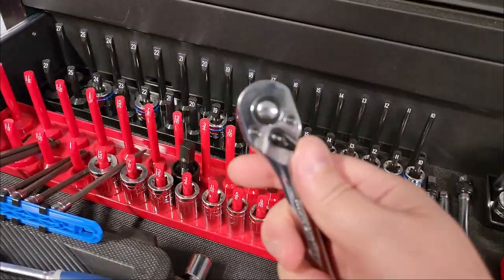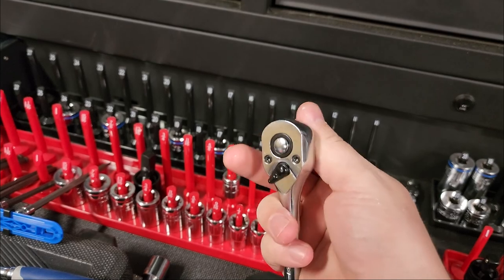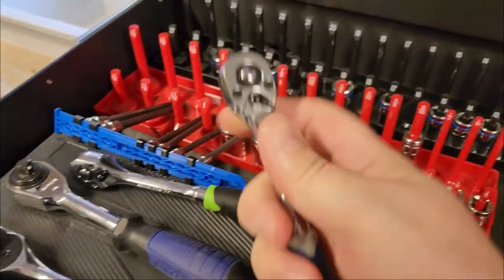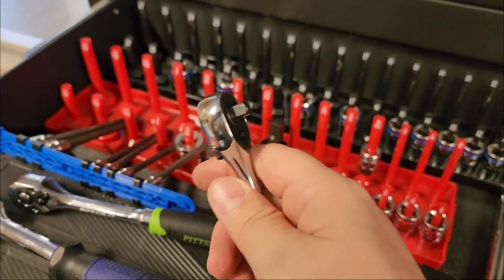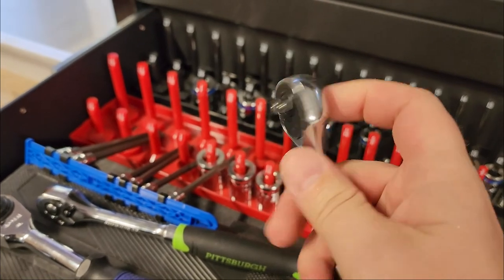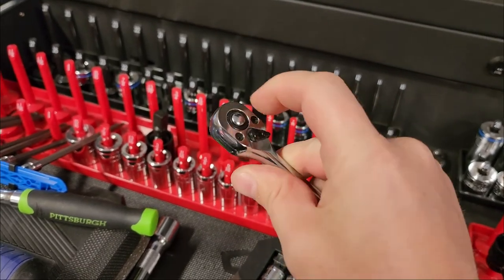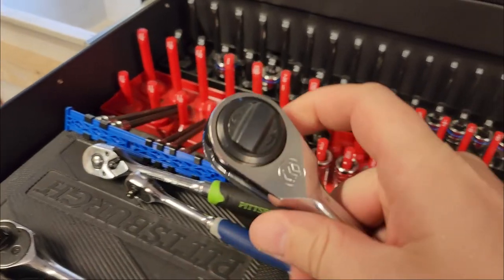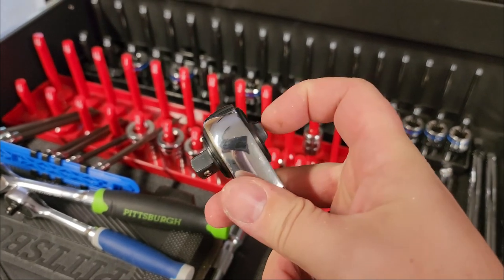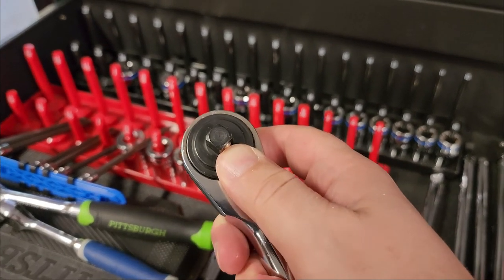Ratchets have almost all the same features. Somewhere on the head is a directional changer that controls which direction it ratchets and which direction drives. There are all different varieties — sometimes it's on the side, sometimes on top. Good ratchets also have a socket retention system, usually a push button. Some use a twist-style directional, which I'm not fond of because it adds length to the head, and a spring-loaded ball retention instead.